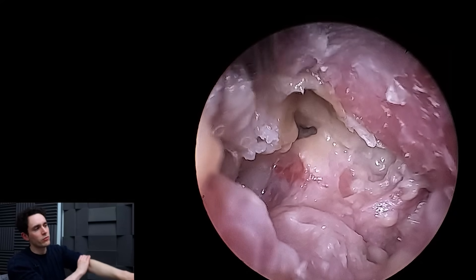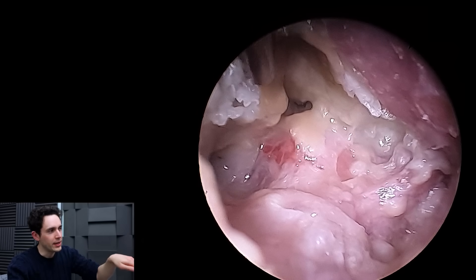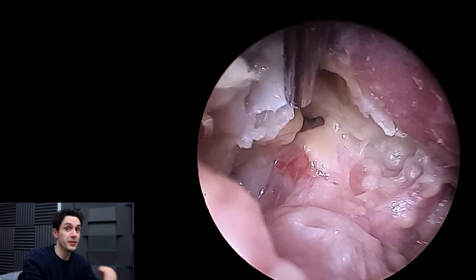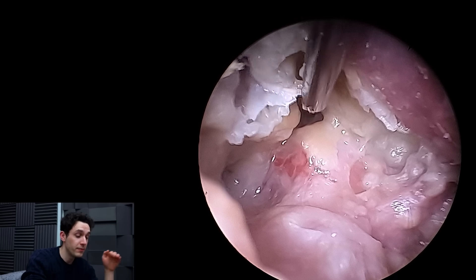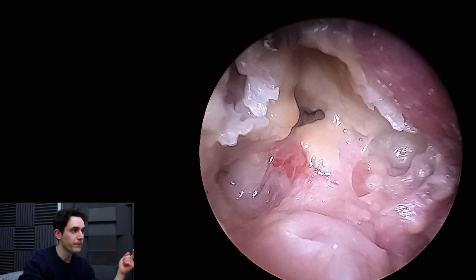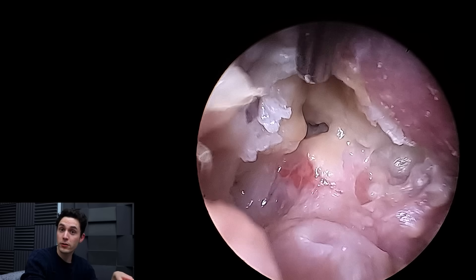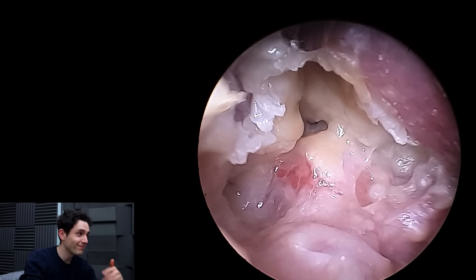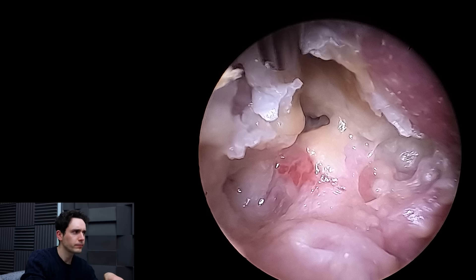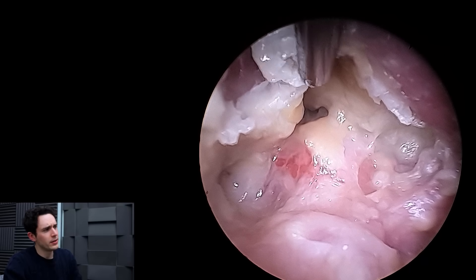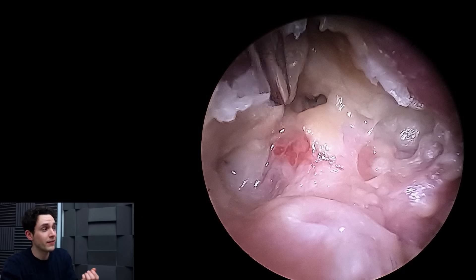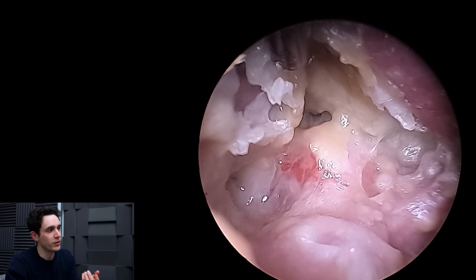That trench, right when you go into the ear, it's off to the lower right-hand side, but it's super deep — you can't see the bottom of it. In part two of this video, which I'll upload next week, we will go in there with an angled scope and I'll try and photograph it nicely, but it's really difficult. You can see the granulation tissue there — that kind of highly vascularized, red raspberry-like tissue. That's the body trying to heal some damage.